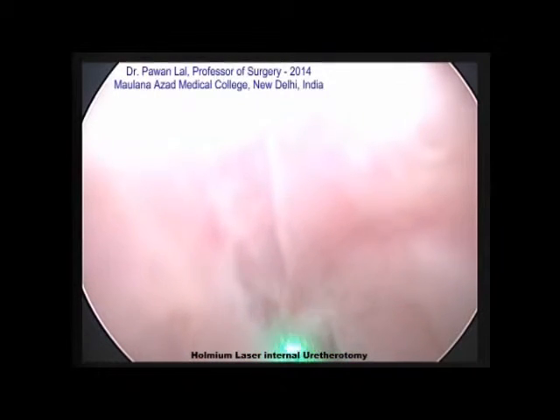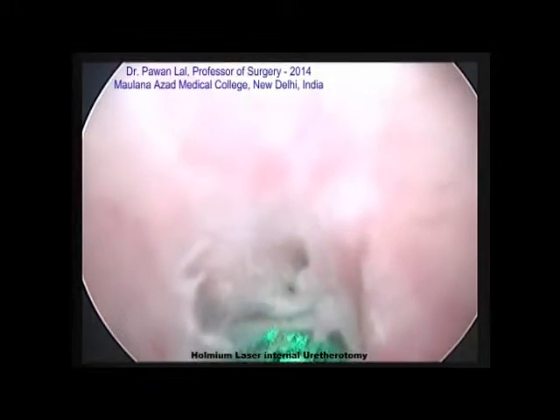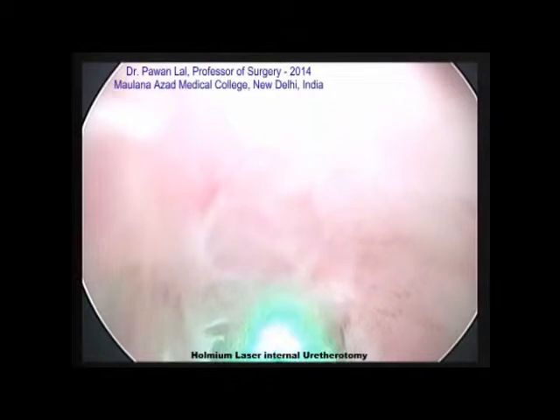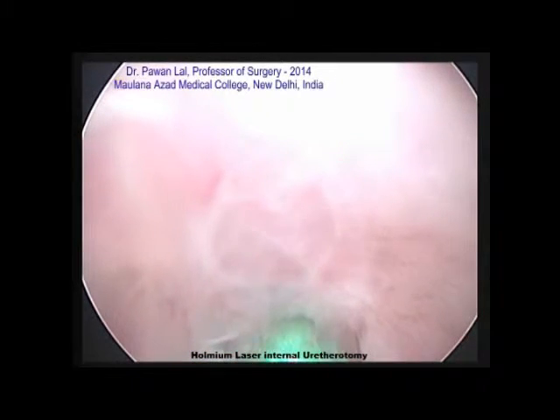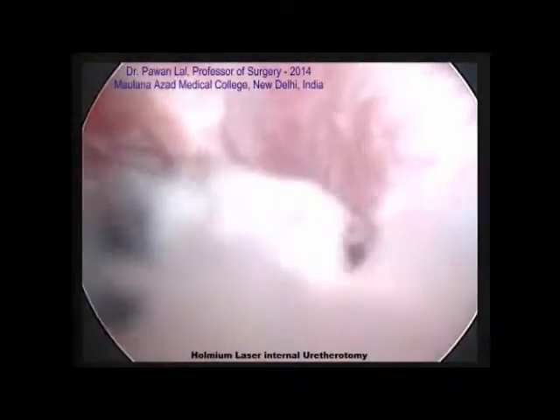There is hardly any bleeding since the coagulation takes place directly with cutting. We are giving an incision on the stricture at the 12 o'clock position. As the stricture is cut, the whole urethra ahead of it opens up. Here you can see the incision being given over the stricture — it's a short segment. You can see the urethra has opened up and there is no bleeding at all; it's totally bloodless. That is the main advantage of doing holmium laser internal urethrotomy.